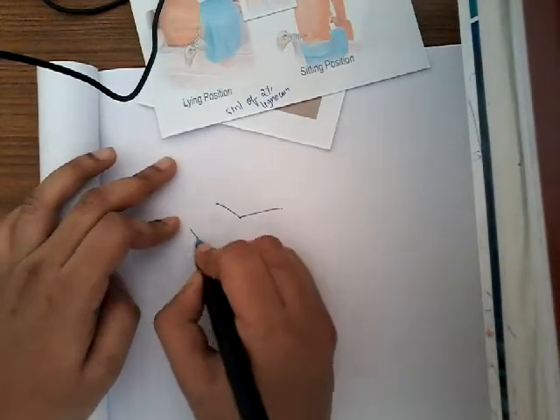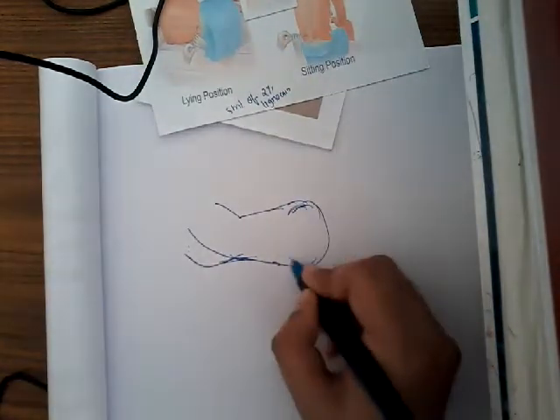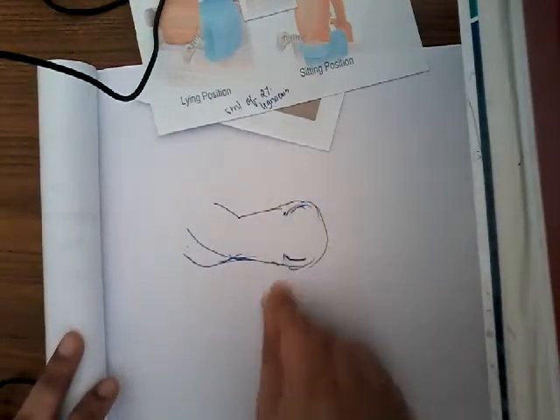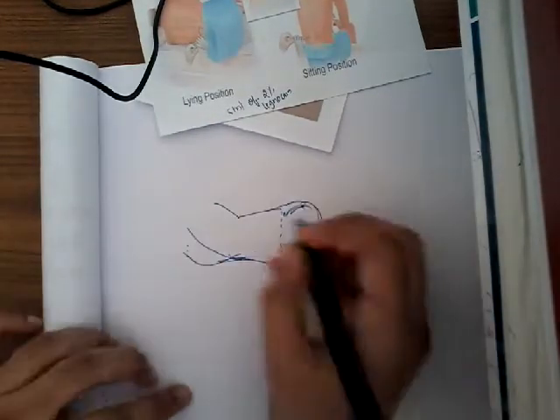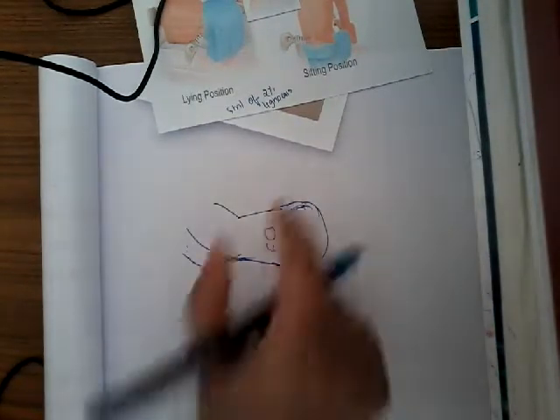With the patient lying down, we look at the iliac crest. At the highest point of the iliac crest, we take a swab dipped in antiseptic solution and draw a line connecting both iliac crests. This line passes between L3 and L4, which is the most commonly used intervertebral space — it is the intervertebral space of choice for performing lumbar puncture.